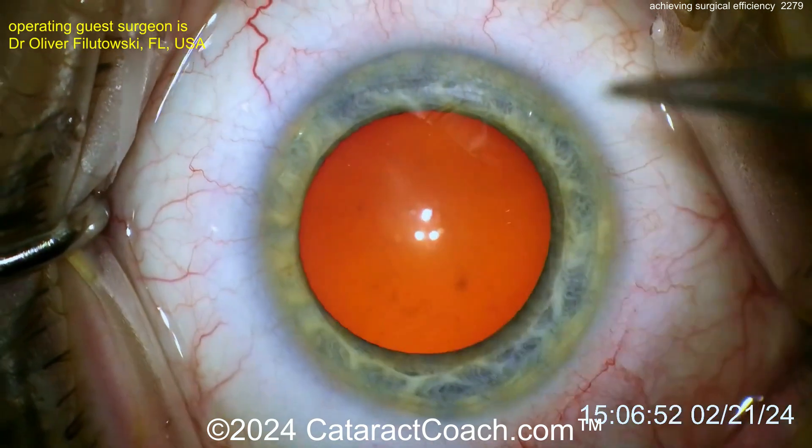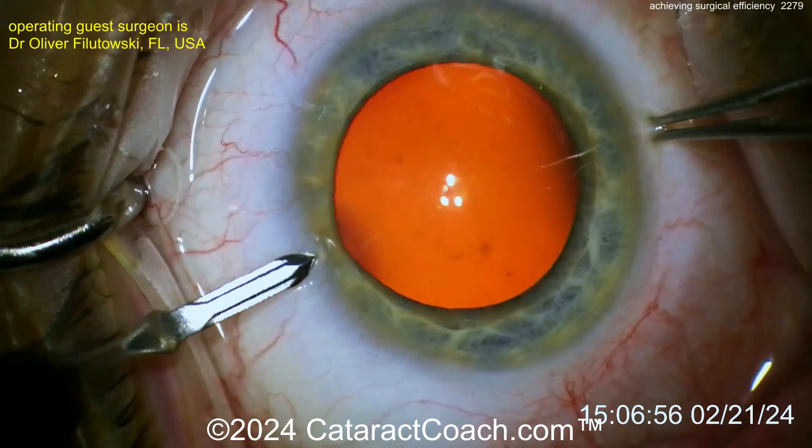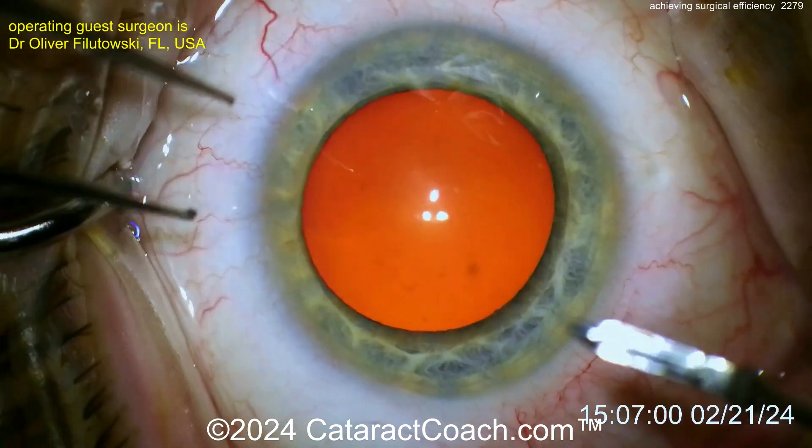Routine case here, unedited. There's a time on the bottom right corner of the screen on the original video. Now starting with a paracentesis there. Good draping, eye in primary, beautiful red reflex.